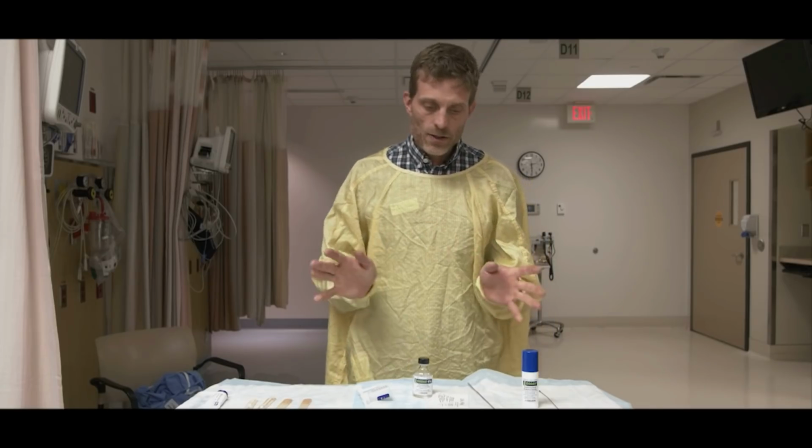And yes, with ketamine, he's going to continue to breathe. Well, certainly with ketamine, apnea is a risk. We do see it. But likely he's going to continue to breathe, especially in the doses we're going to supply to facilitate our awake intubation. But he may just lose a little bit of that connection, dissociation, and the view we got when he was completely awake and alert is not necessarily the same view we may achieve after we give him some sedation. We may just see a little bit of that obstructing airway pathology get worse. So ideally the procedure is done just under topicalization.